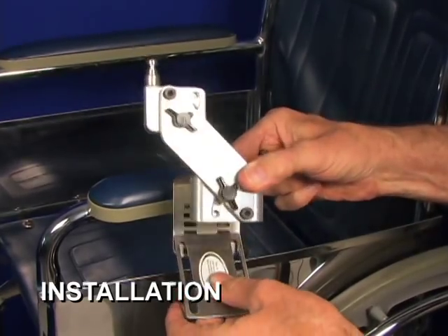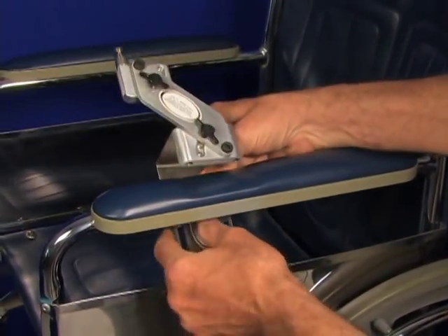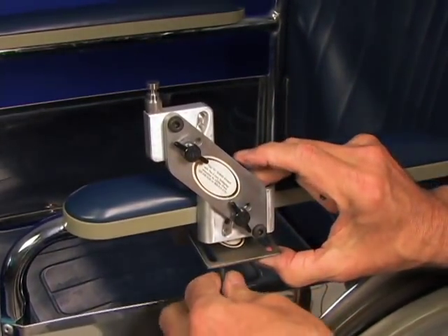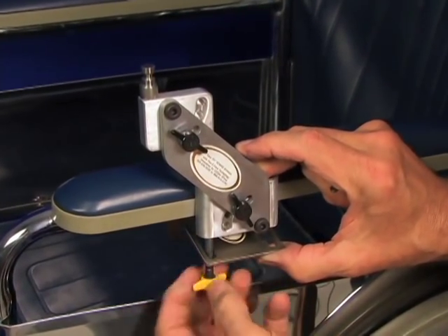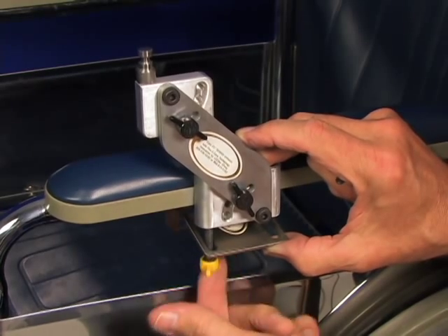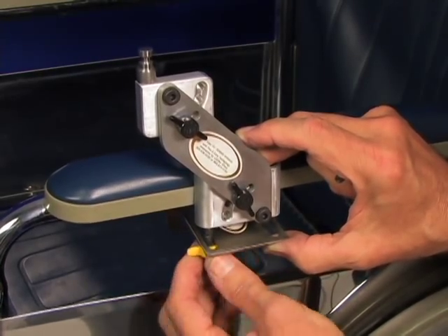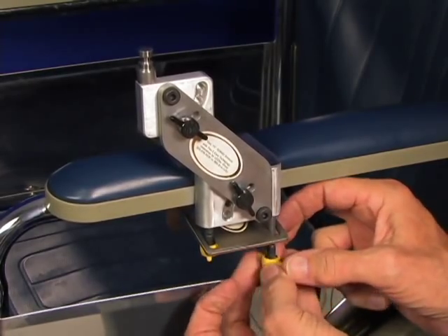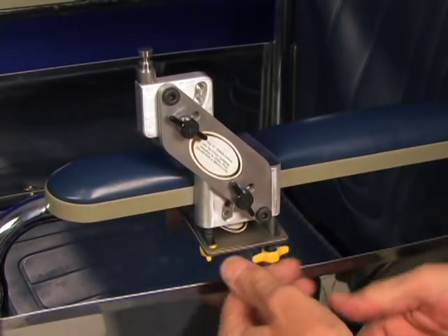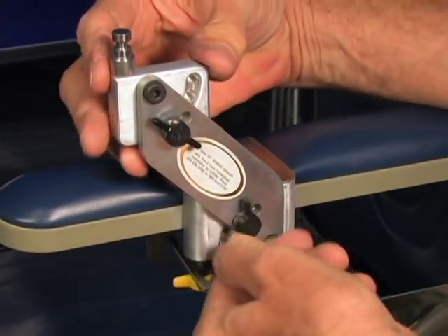The SoHo is applied to the wheelchair around a normal wheelchair armrest. You have to size that bottom plate — which has different slotted adjustments — properly to squeeze that armrest tightly enough to hold it in place. There's a considerable amount of pressure that can be exerted by the upper body leaning against this, so you've got to make it pretty snug. These bolts, when wound all the way up nice and tight, will do the job just fine, and you can see that the unit is firmly attached.